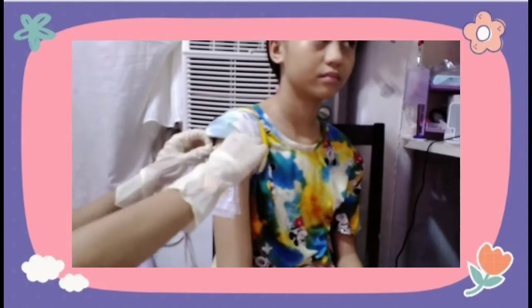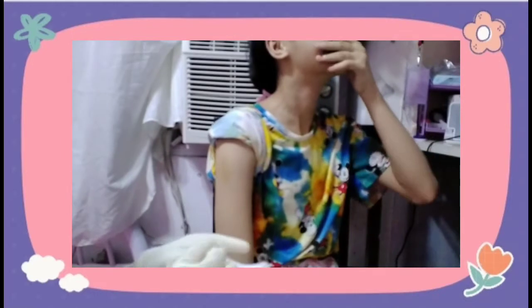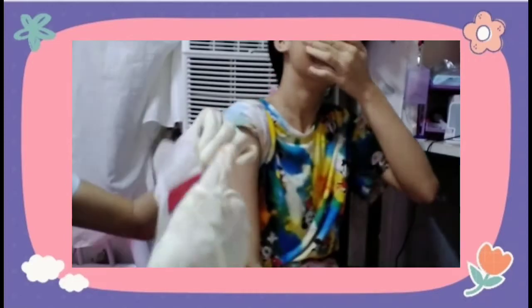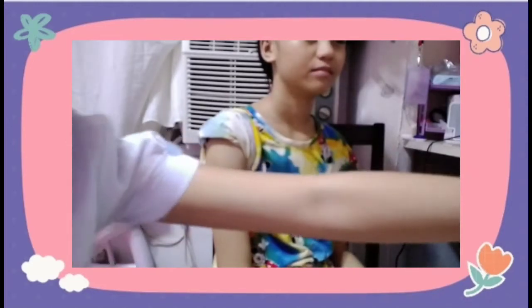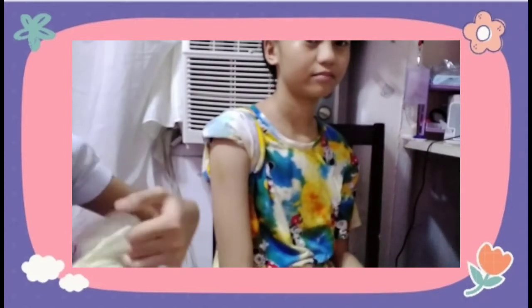Now I'm going to remove the outer dressing and observe any drainage on the dressing. Hold the dressing so that the client does not see the drainage. And now I'm going to discard the dressing in the moisture-proof bag. Handle it carefully so that the dressing does not touch the outside of the bag.